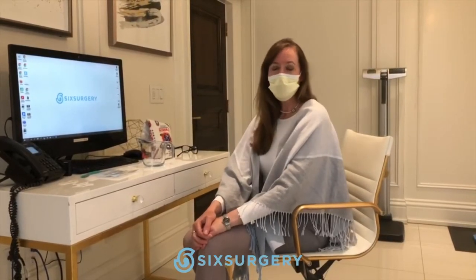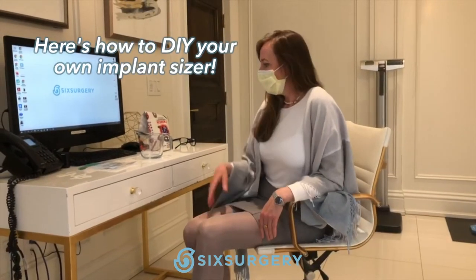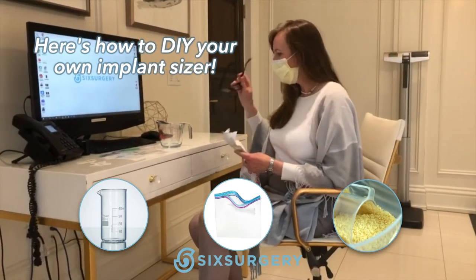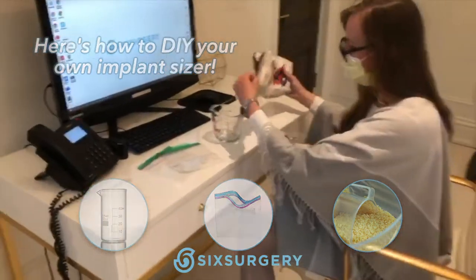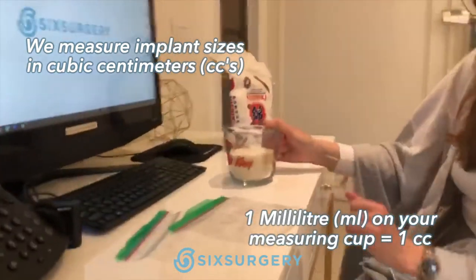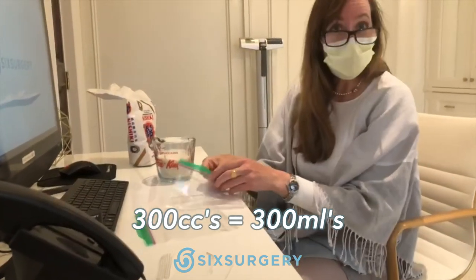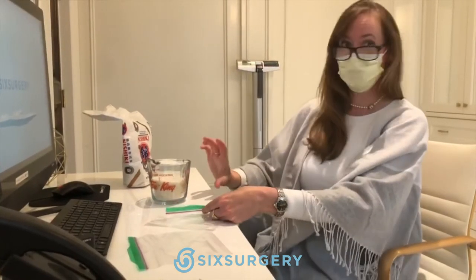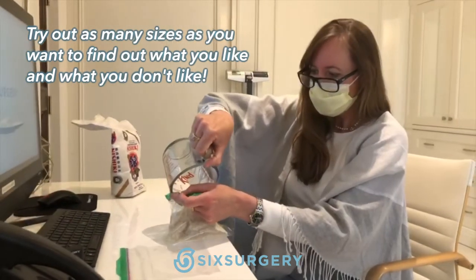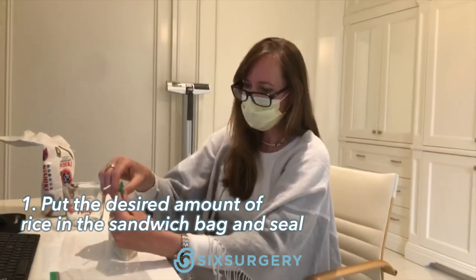One of the things we wanted to talk about was something you can do at home when you don't have access to the sizers like we have in our cupboards. You take a Pyrex measuring cup, a couple of sandwich baggies, and some uncooked rice. You're going to put the rice in here, and you can seal it — I usually use a twist tie too.